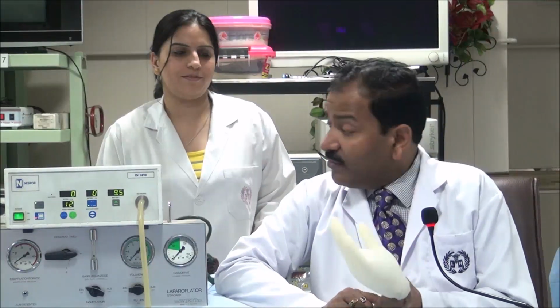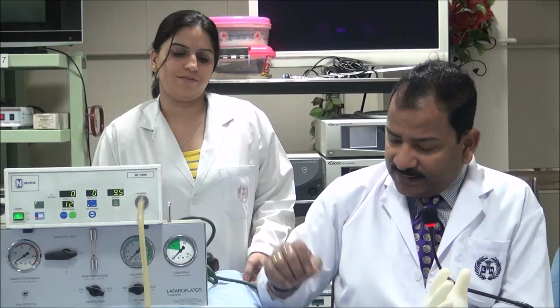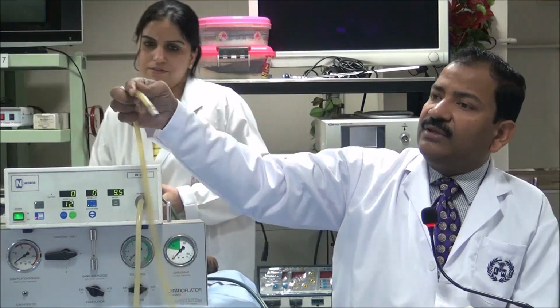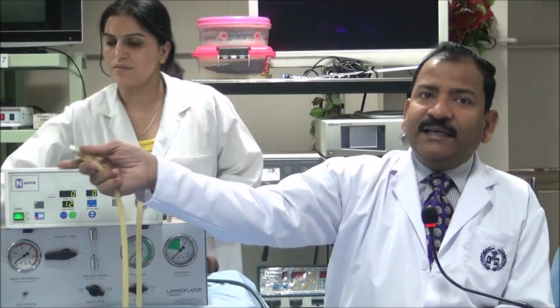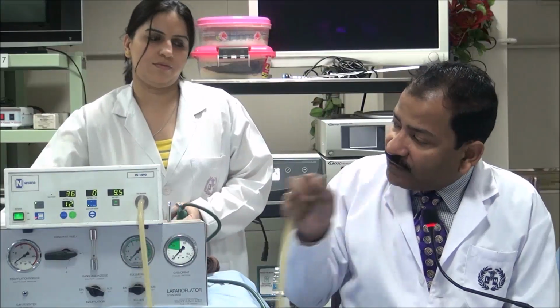Now the question is, when she is pushing, how will I know whether it is 12 or 18? That is very easy. You connect this tubing of the insufflator to another cannula, and then it will give you the pressure, because the pressure will go like this. Can you see that?